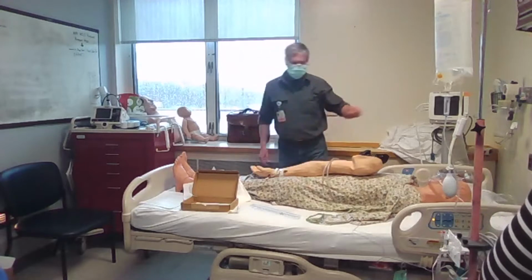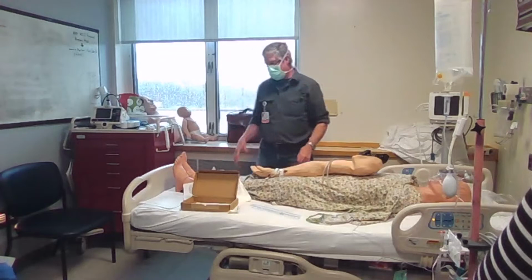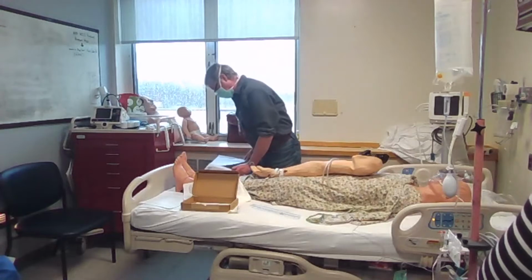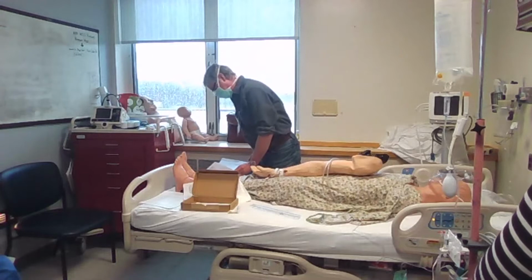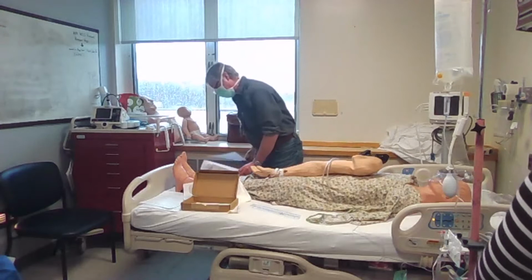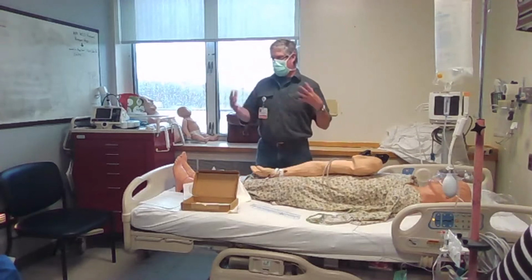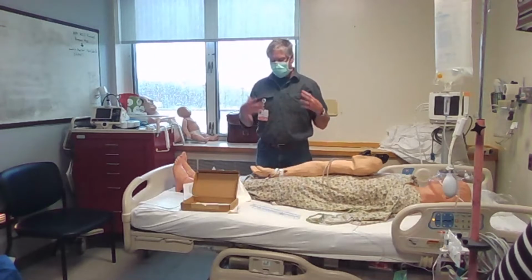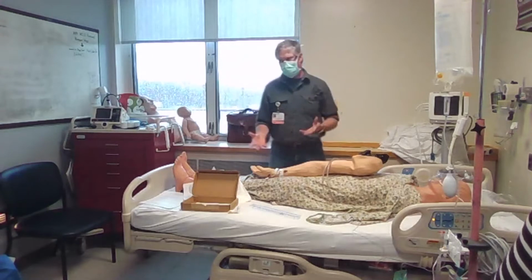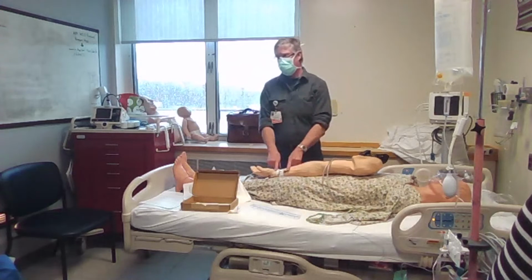So if we're troubleshooting it, say you get it hooked up and you're not quite getting a good waveform. Okay, there are some things in here that talk about troubleshooting, which I'm probably going to butcher. I'll say it right now, because I read all this stuff when I had to know it for anesthesia and the board exam. Without getting into the nitty gritty of why it works and what you're looking for, the big things to be able to do are to be able to draw blood off of it and to make sure that it stays patent.